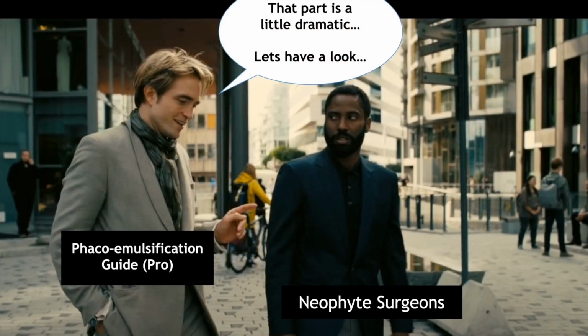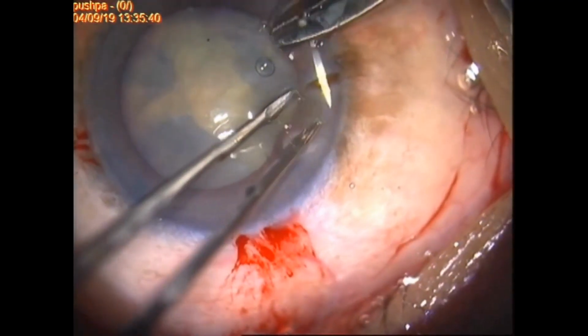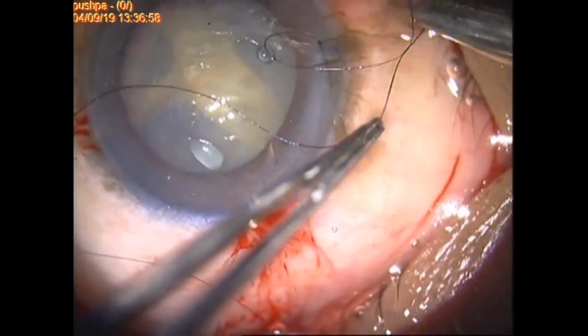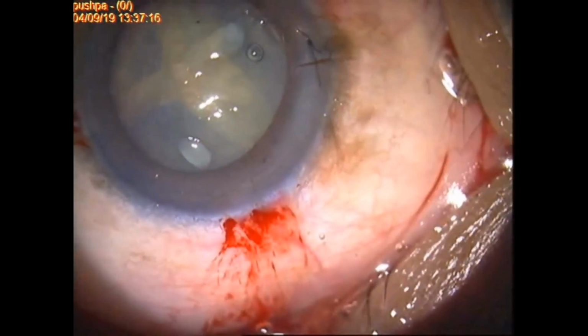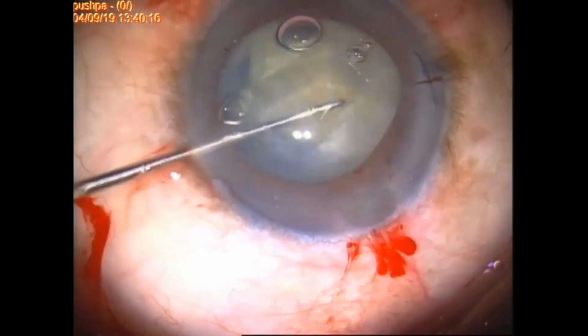Let's have a look. Once that particular complication had happened, I wanted to secure the side port corneal tear to have a steady anterior chamber during Phaco maneuvers. Any fluctuation in the anterior chamber will only further propagate the equatorial tears into the posterior capsule. Slow motion Phaco-Emulsification was proceeded to minimize the stress on the zonules.